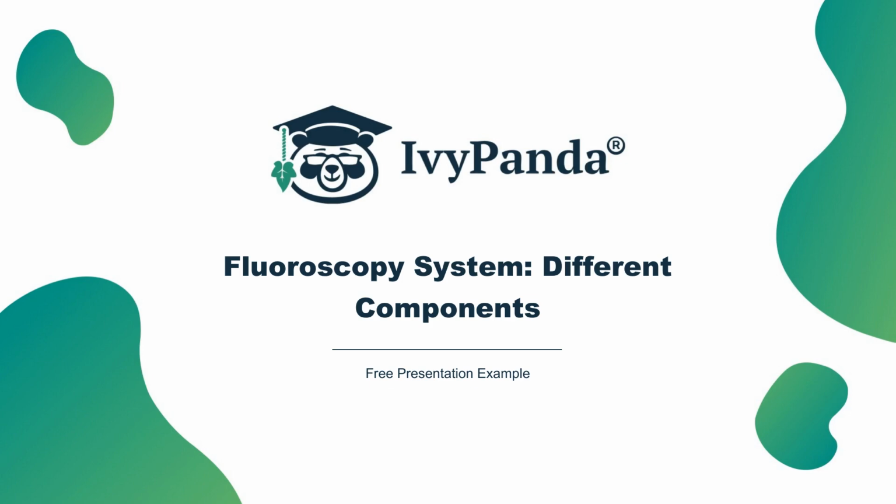Their outermost layers differ as well. Direct conversion FPD have high voltage bias electrodes, while indirect ones use phosphor screens. One can see the differences between the two types of FPD. Direct conversion FPD convert X-rays into a charge. After that, the charge is processed by a TFT, that is thin film transistor, or CMOS, that is complementary metal oxide semiconductor, array. The processed electric charge is sent off to the computer, where it is processed and converted.